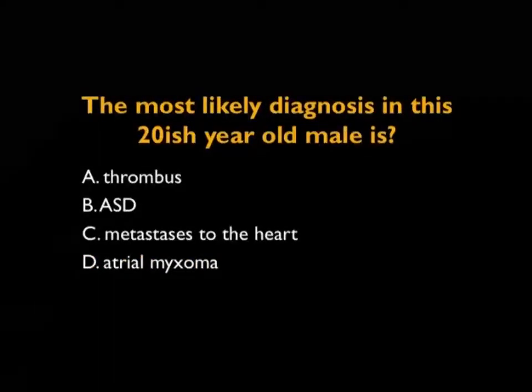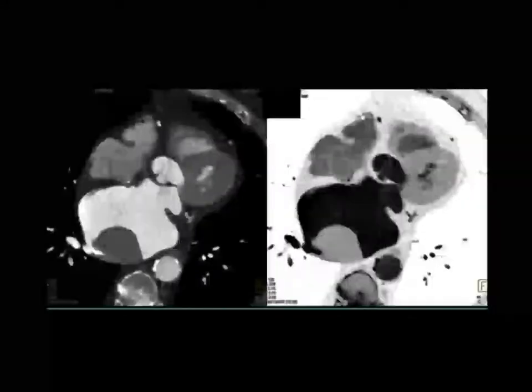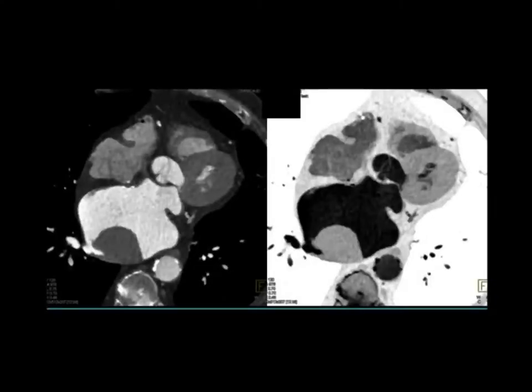This is a pretty case. This patient had chest pain, and I want to know what the most likely diagnosis is. You can see a flash acquisition, very nice mass in the posterior aspect of the left atrium. You can see it both with the positive and negative display. Well, what could this be? I guess in theory it could be a thrombus, but that would be a very strange location, and that would be a very large thrombus, and I don't see a line in place.